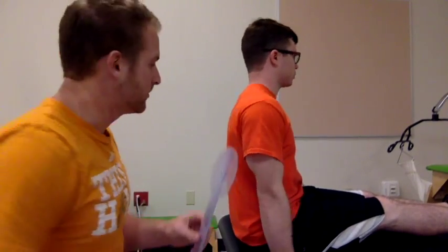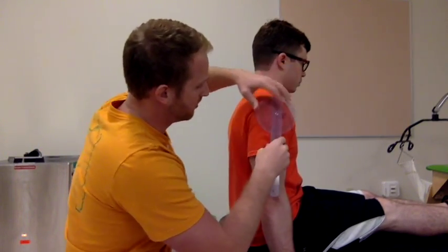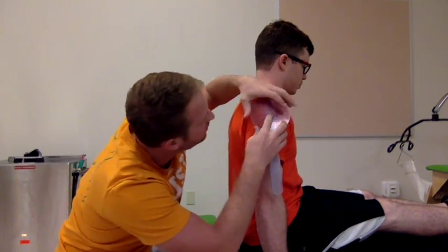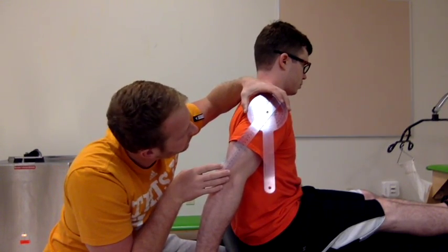This is shoulder extension. You find the humeral head, which is going to be 1 inch below the acromion process. And then both arms down like this. So go ahead and perform. Looks like we got 37 degrees.